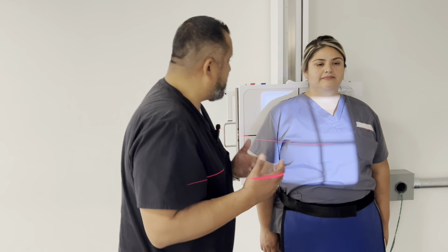All right, so obliques are not a common projection or position that we do in the field. Again, CT has taken over a lot of the exams we used to do in terms of x-ray, changing different x-ray positions, but we still practice them and they still come up on the registry and the ARRT exam content specifications, so we're going to review them for you, okay?